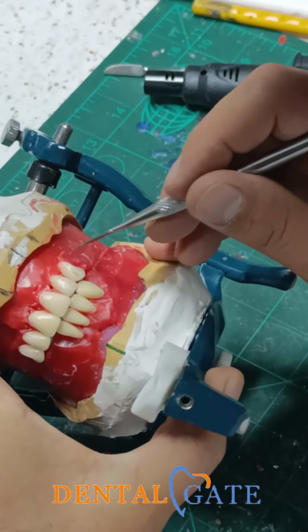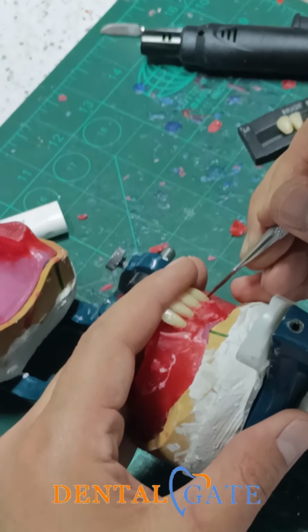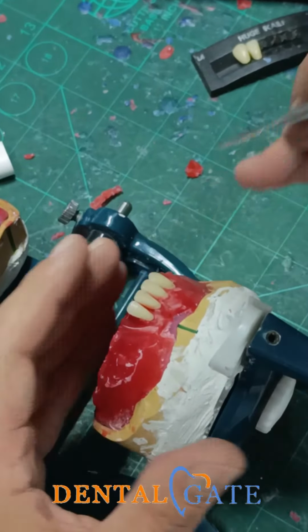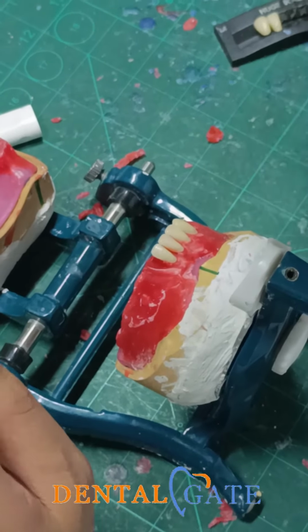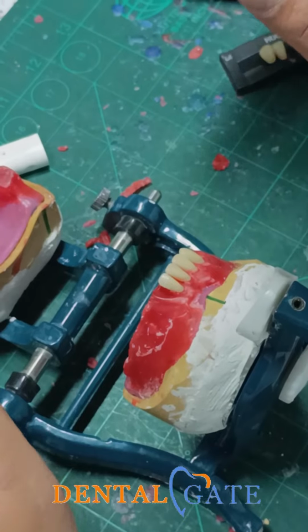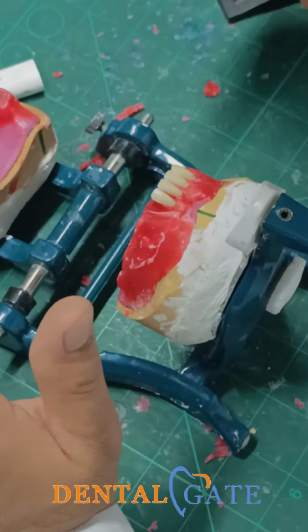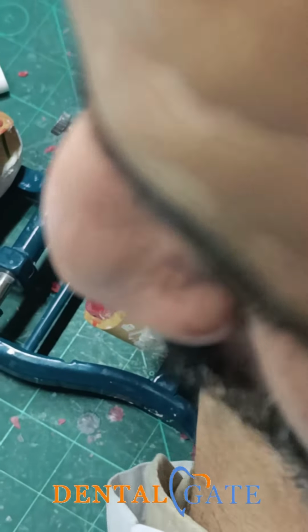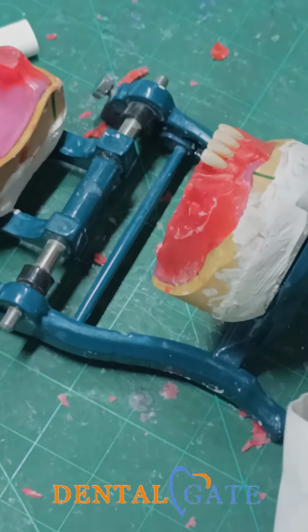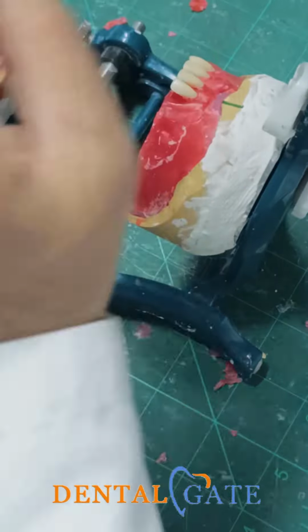When I make a correction in the upper, I don't need to make inclination now. But sometimes with the patient's mouth, it is mandatory because I cannot preserve the one level of overjet overbite. I need to make inclination. This is for you. If you want to make it, you can do it. Okay? You can push it lingually. You can make inclination, but not severe, and preserve the aesthetic. To what? To produce the canine relationship with the normal criteria.